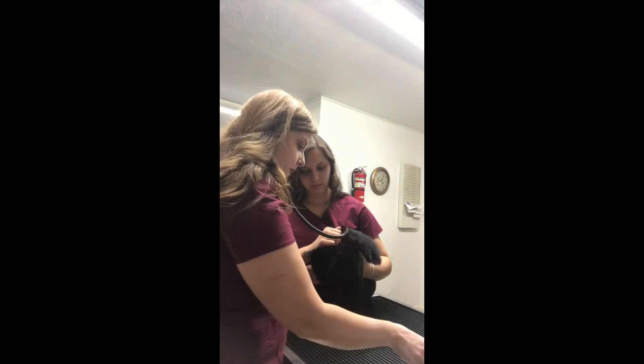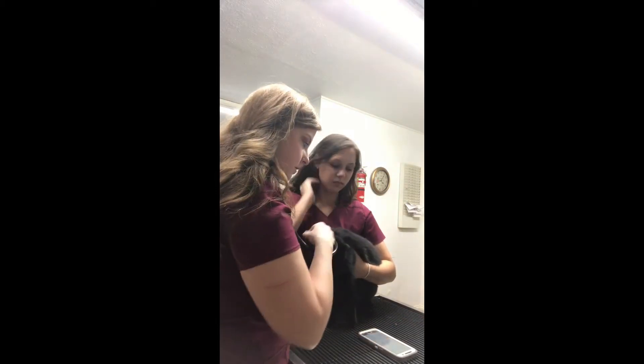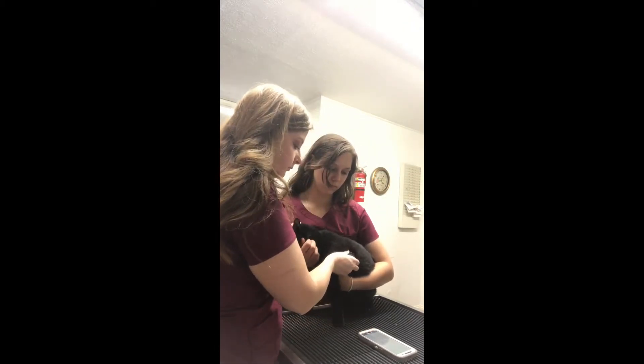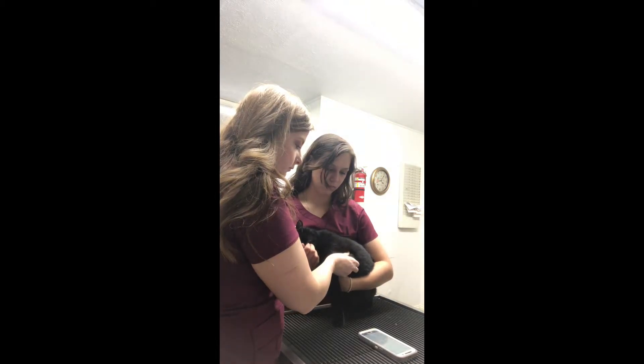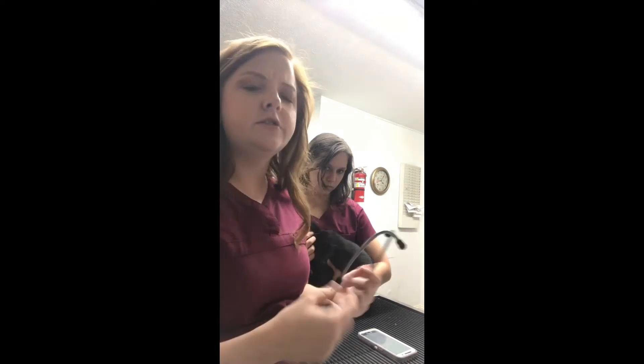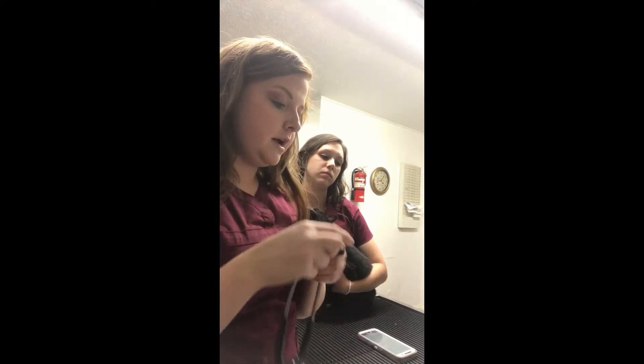That all sounds good. Now I'm going to get her respiratory rate. I'm taking breaths per 15 seconds — it's really hard to do with her purring, but it sounds like about eight breaths per 15 seconds. You take that and multiply by four and you get 32. Her respiratory rate is 32.